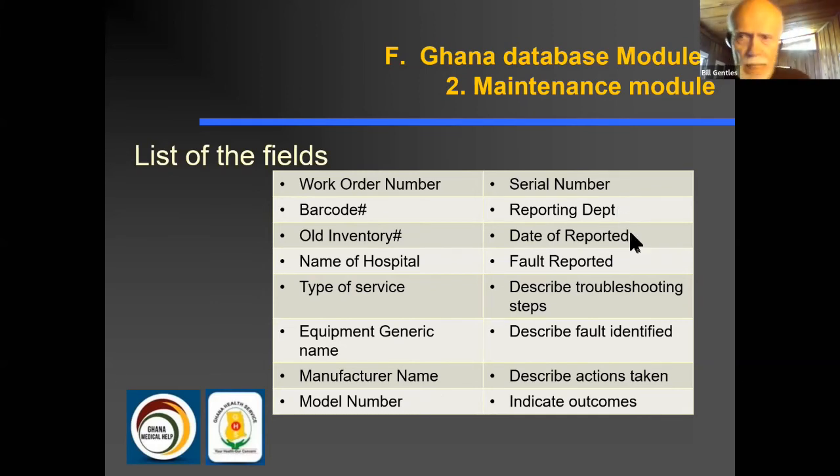Then some more specific equipment information about the equipment, who reported the problem, who's the reporting department? What was the date they reported the problem? And how was the fault reported by them?